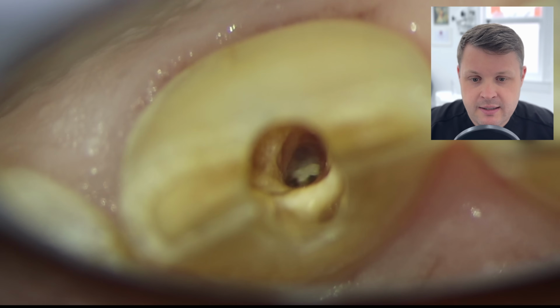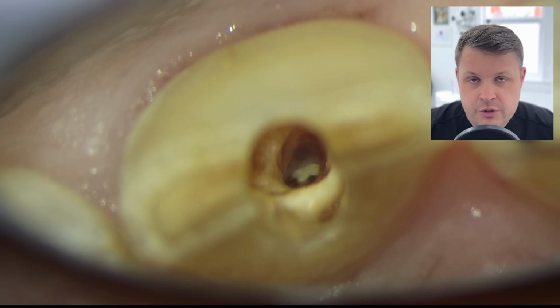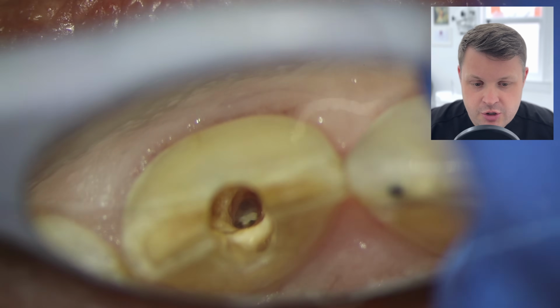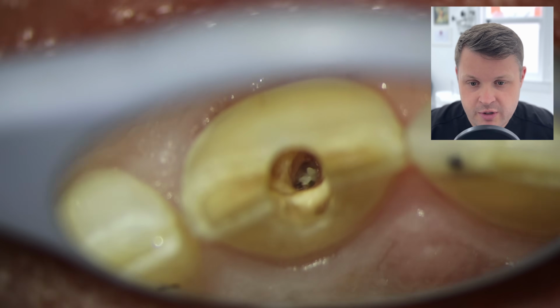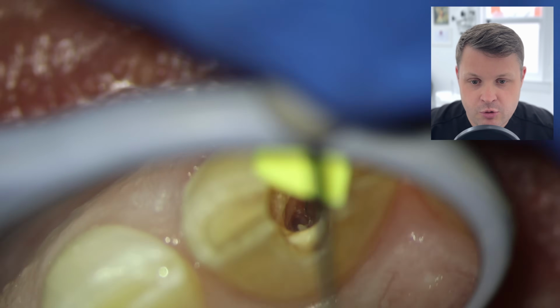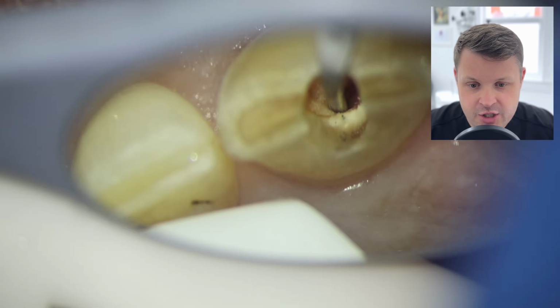And in fact, I thought that this is the area where I should be going. So I am going to just change tack here. I'm going to feel like I'm looking straight down the middle of the tooth, and I'm using my diamond-tipped ultrasonics to go in the direction that I should be going in.